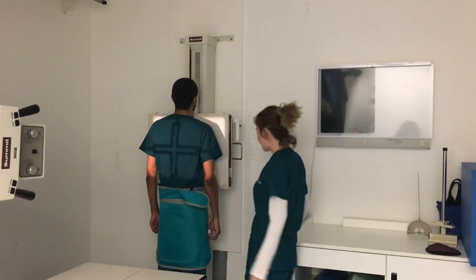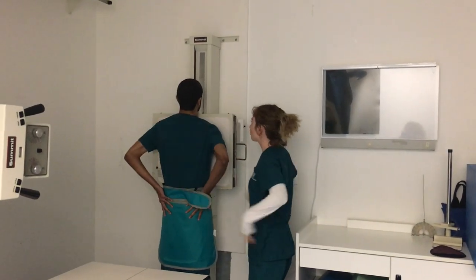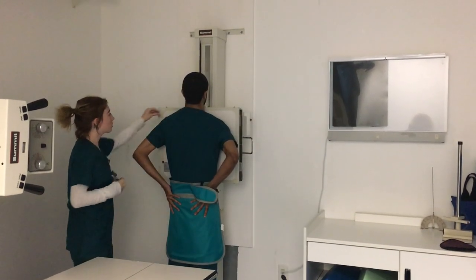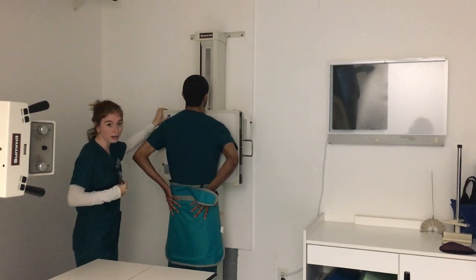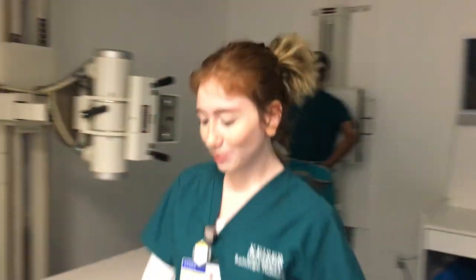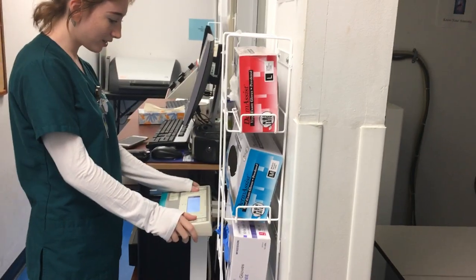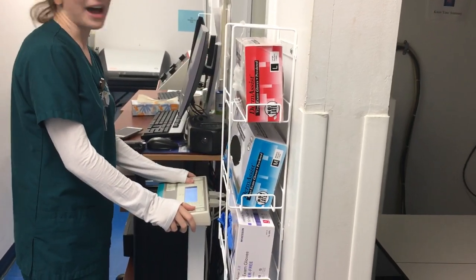I will now have you put your hands on the back of your hips and roll your shoulders forward. And put my left marker on his left side, but out of his body. And then come over and set our exposure factors to 110 KVP and three and a half mAs.